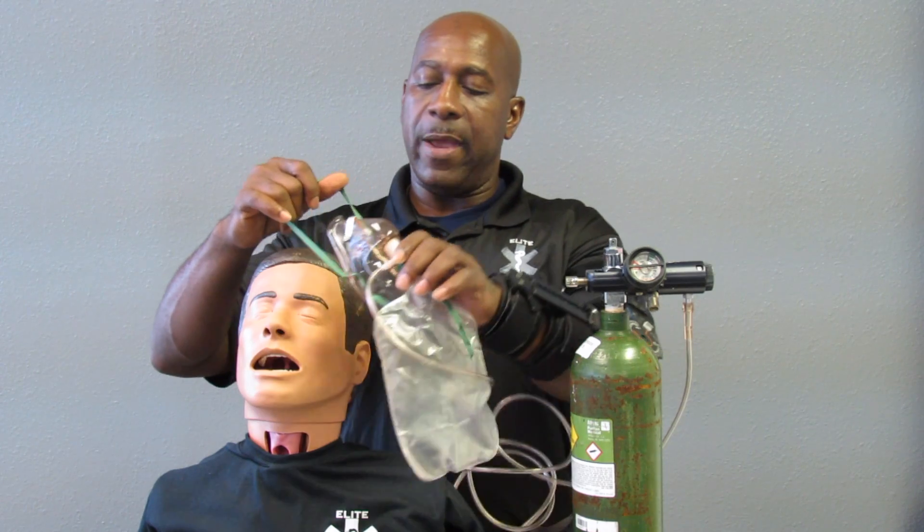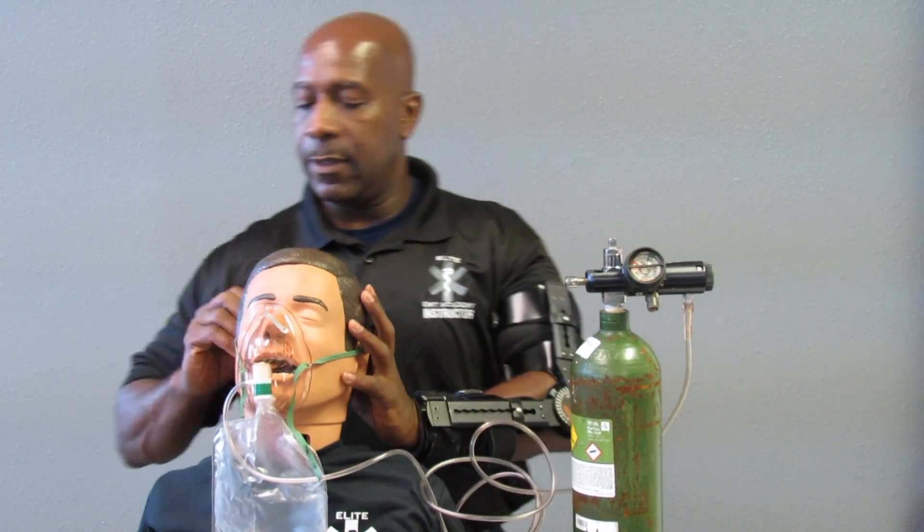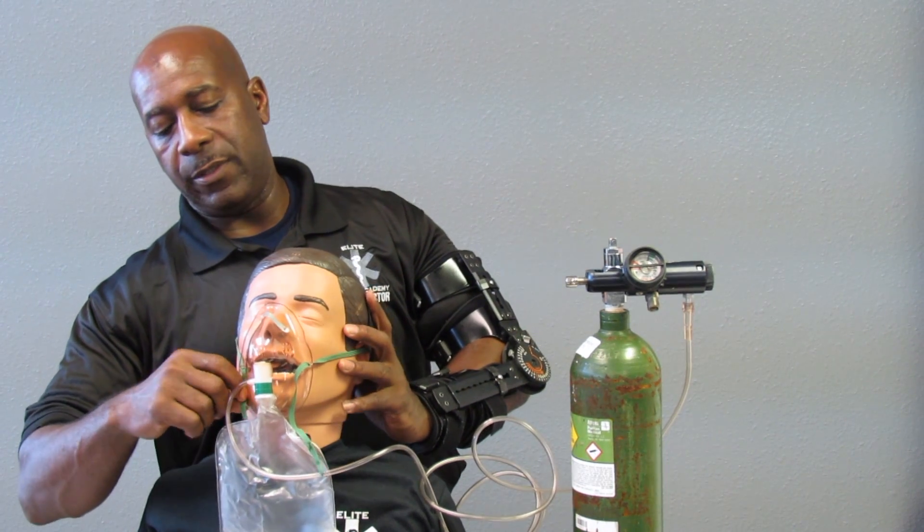Once your reservoir bag is pre-filled, you want to adjust it to your patient's face and tighten the support to the face piece.